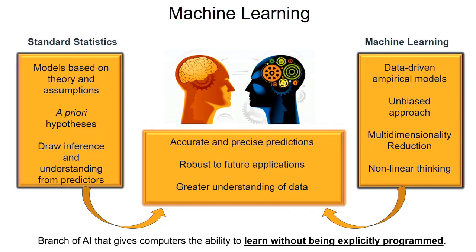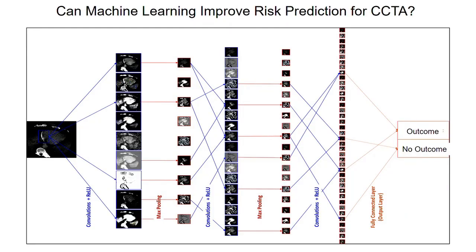The other thing is that this whole deep learning thing, it's not really a thinking machine, but just these empirical models that are based upon large amounts of data. But the claim is that these deep learning algorithms can continue to improve with the addition of more data without a hypothetical plateau, right? So therein, I think, would help a lot.